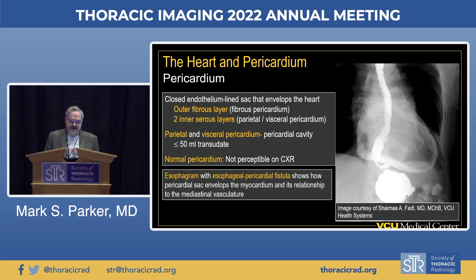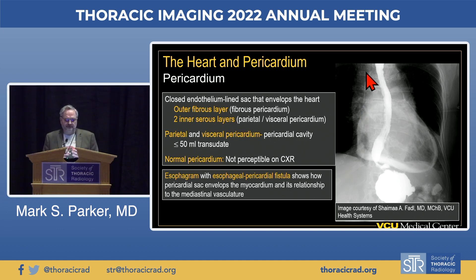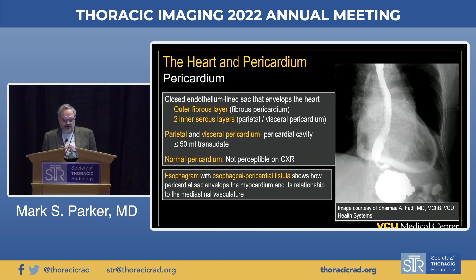This is illustrated in a patient who had radiofrequency ablation therapy complicated by an esophageal-pericardial fistula. Barium swallowed spills freely into the pericardial sac, outlining the myocardium as a halo, but does not extend above the attachment of the pericardial reflections at the vascular pedicle. Keeping this in mind, whether there is air or fluid in the pericardial sac, you can differentiate that from pneumomediastinum.